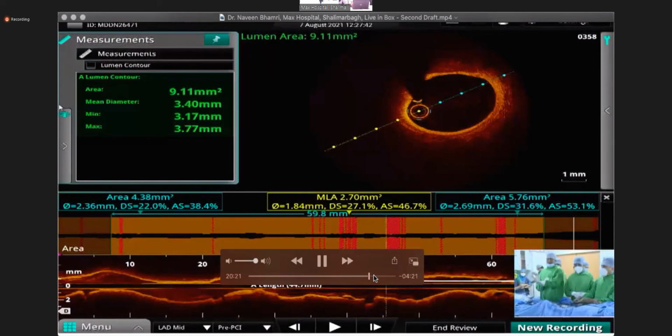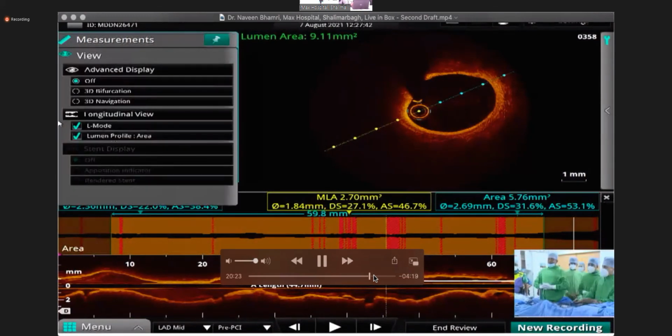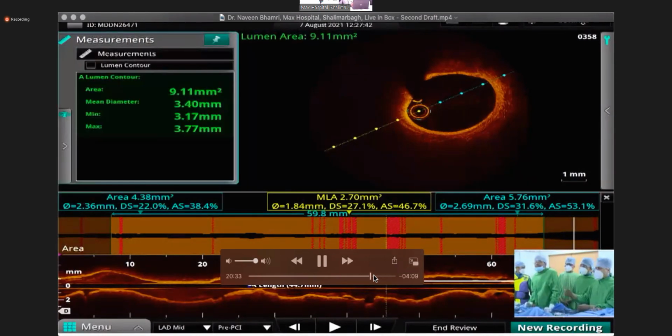We should go with a single stent or two stents? I think the two stent strategy is better because we have a disparity of the proximal diameter, 3.5 and 3. And another thing is, it is borderline. We have the highest length of around 48. Okay, you want to try with a single stent first.